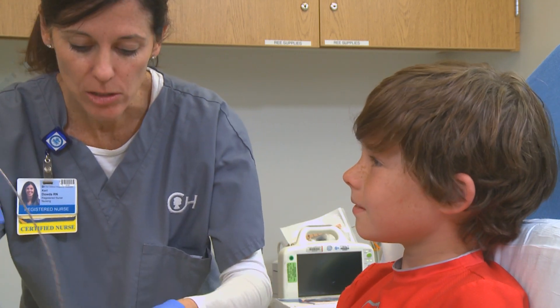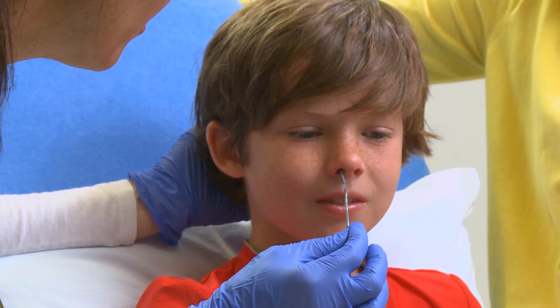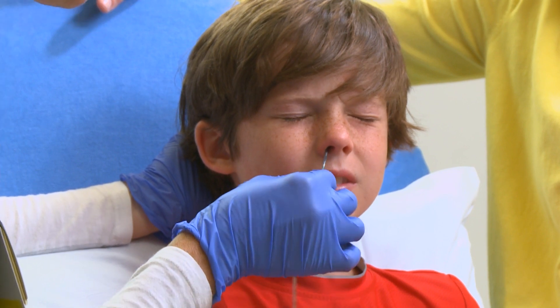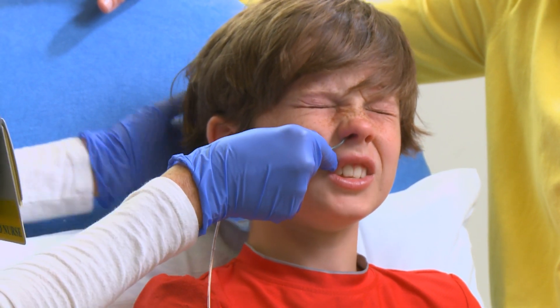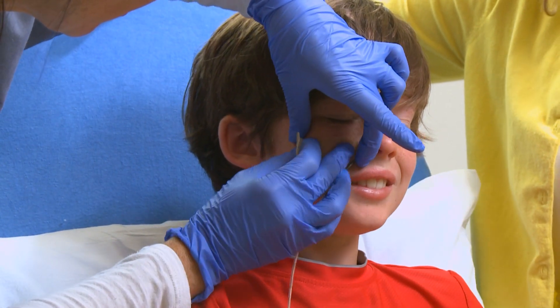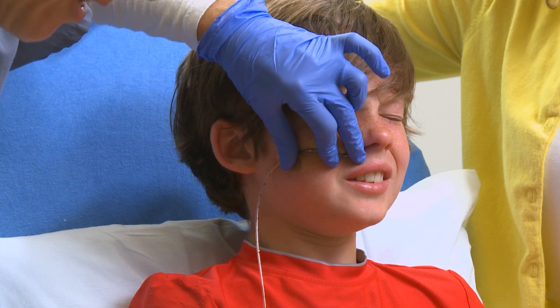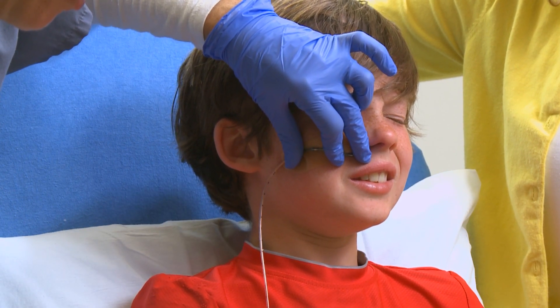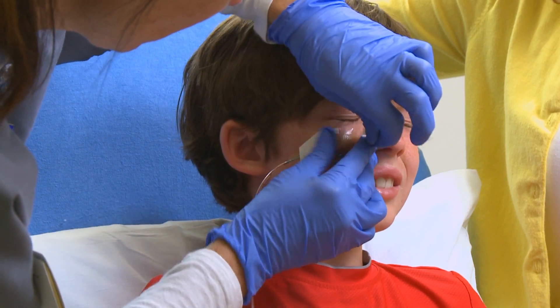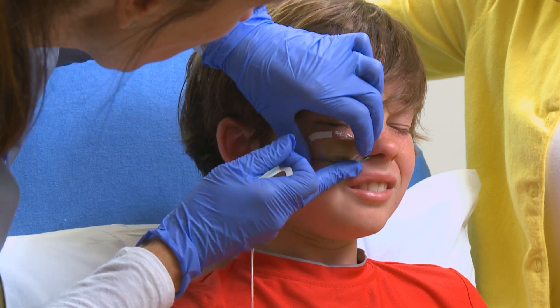You ready? When I tell you to, I want you to swallow, because your swallowing helps the probe go down. Ready? Swallow. Swallow. Great job. All right, we got it where we want it to be. I'm going to put the special tape on it, and you can hold on to my hand if you'd like to. Perfect, and this will help keep it in place. Sometimes you do sneeze once it's in, but you'll get used to it, I promise.